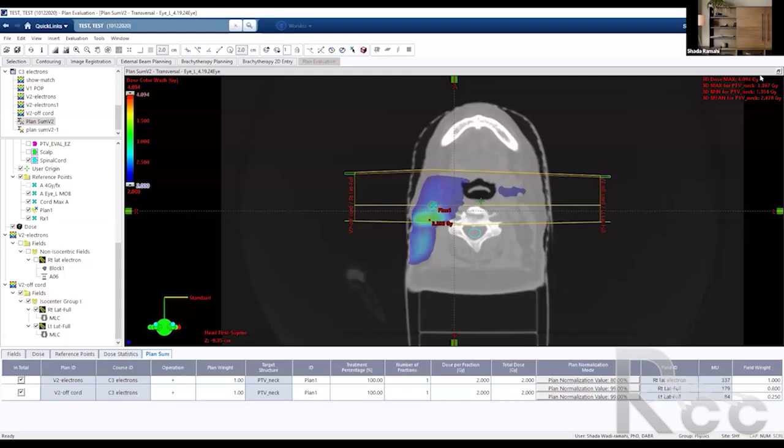And that's why once you bridge into IMRT planning, IMRT is best for head and neck because you don't have to deal with electron photon match. And it's something we talked about back in the day when we went from 2D to 3D and started realizing, oh, what we see in the physics book, we're seeing it live here in the patient. It happened before, but we didn't see it. Now when you see it, it becomes more real.